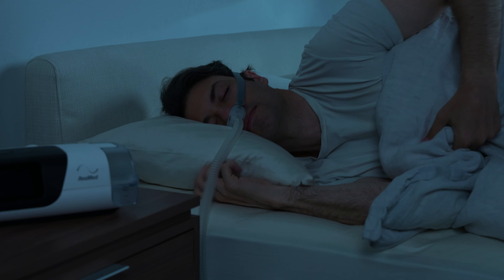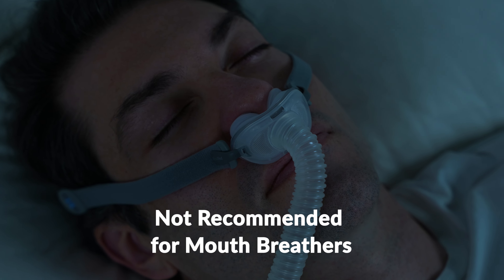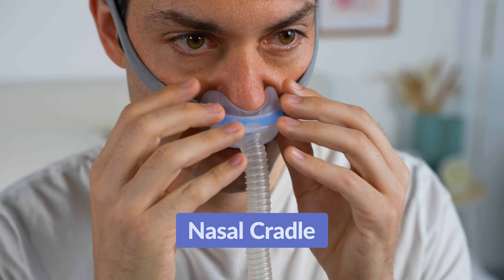Some advantages of the nasal pillow mask are that they're small, lightweight, and minimalistic. It's easy to change body positions during the night, easy to take on and off, and great for people with facial hair. It minimizes red marks on the face and skin irritation, comes in fit packs to accommodate different nostril sizes, and generally has fewer mask leaks compared to other options. However, it's not ideal for higher pressure settings, as it can make breathing out against the CPAP pressure feel more difficult and can cause more leakage. There's also a potential for sore nostrils, and it requires breathing through the nose only — it won't work if you're a mouth breather or have chronic nasal congestion.